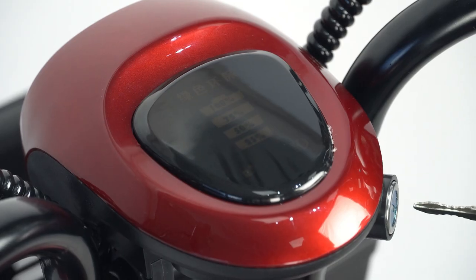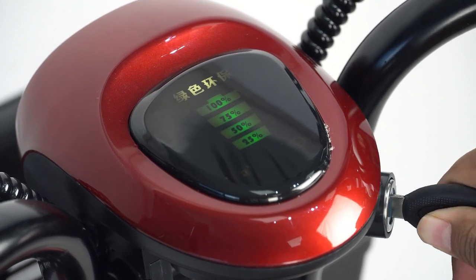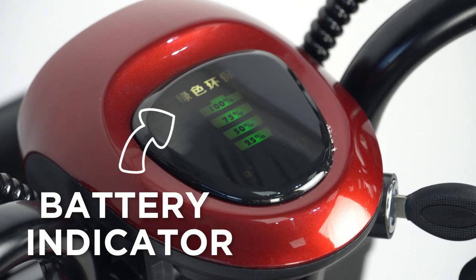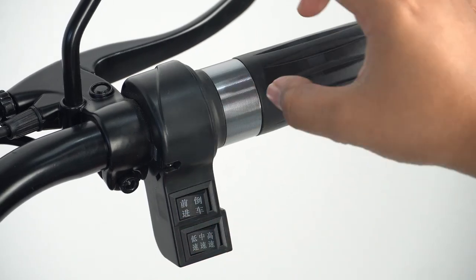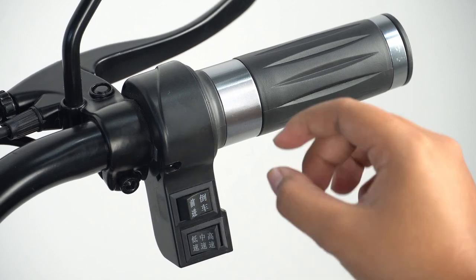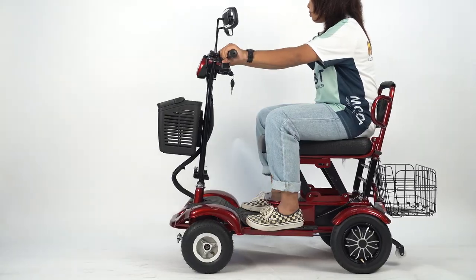How to use: Slot the key into the power ignition and twist to power on the device. The battery indicator will light up. Press the forward button and twist the throttle to move forward. Press the backwards button and twist the throttle to move backwards.